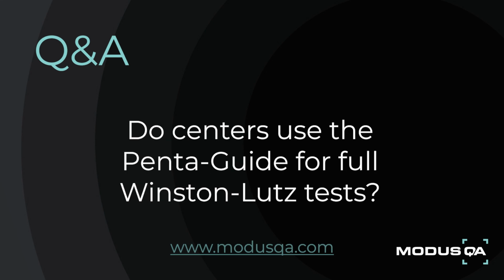Okay, thanks. Do centers use this for full Winston-Lutz tests? Typically, you would want to use a Winston-Lutz for a little more detailed alignment and being able to make those adjustments. We do offer a proper Winston-Lutz wand where you can do very precise adjustments to your lasers. What you would do with this device is use it for Winston-Lutz type testing to alert you to actually do further investigation. So this is what you would use for a daily process.